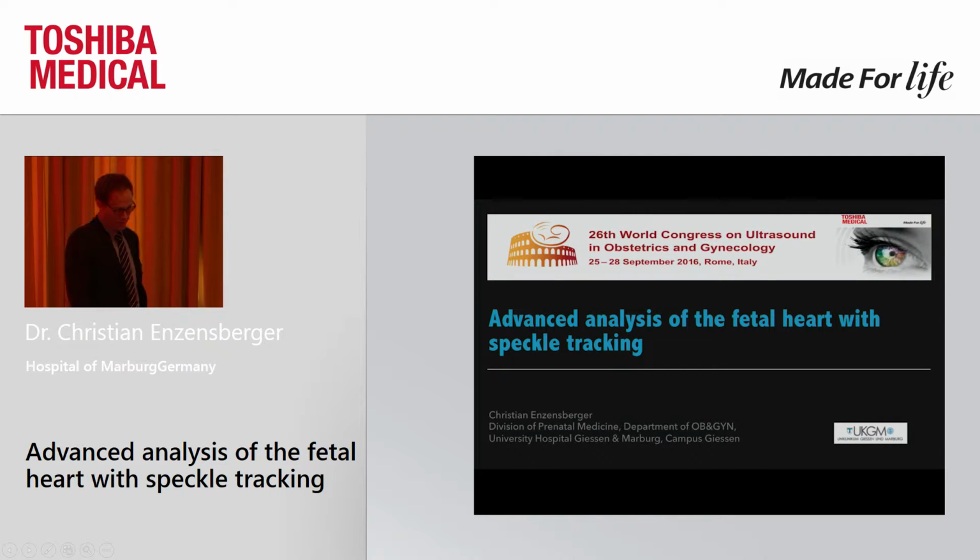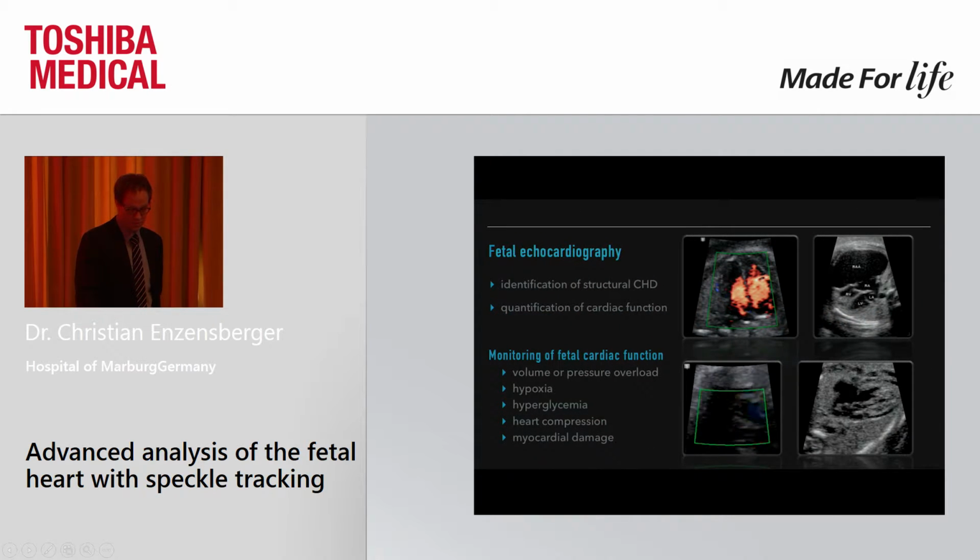Colleagues, as Dr. Sim already said, I would like to speak about this advanced analysis of the fetal heart with speckle tracking. It is, as he already said, a new technique, and I would like to show you within the next slides what we can already do with this technique.